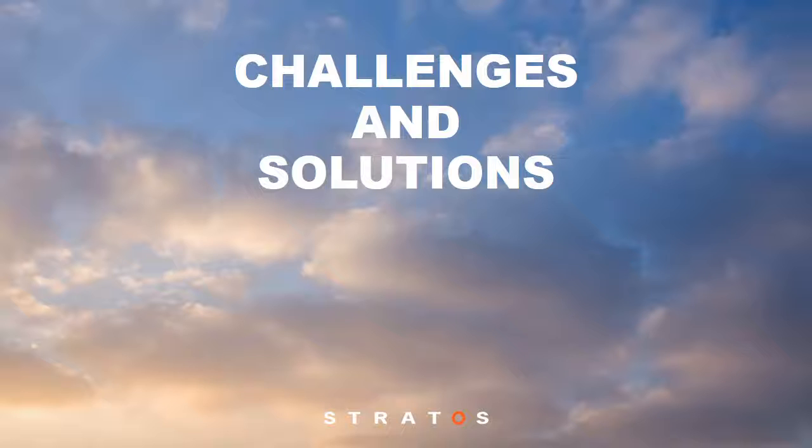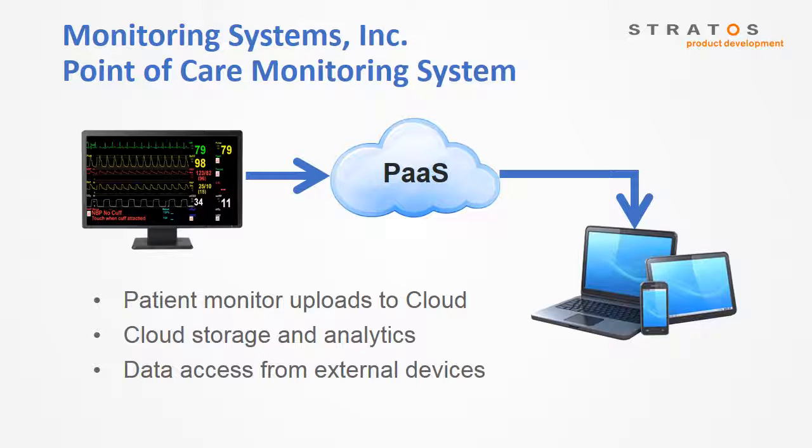Serious flaws can occur in even the simplest cloud-connected system, so I've put together an example of a simple connected medical monitoring system for us to consider. Here's a very simple diagram of a cloud-connected patient monitoring system. Patient data is uploaded to the cloud. Analysis tasks run and store their results in the cloud. Staff and care providers can retrieve data and analytics to their mobile devices.